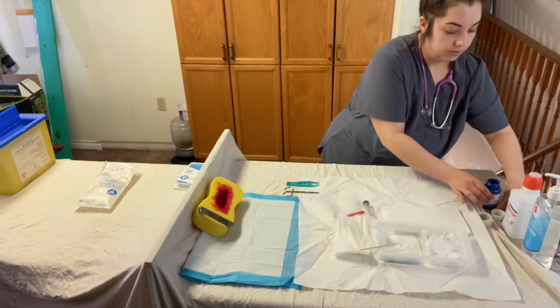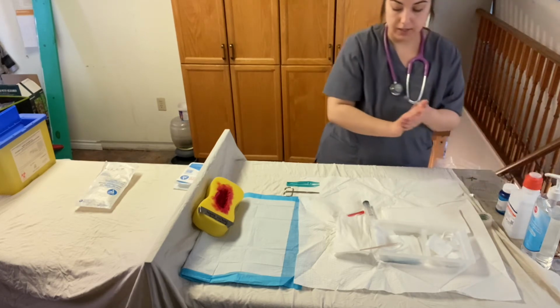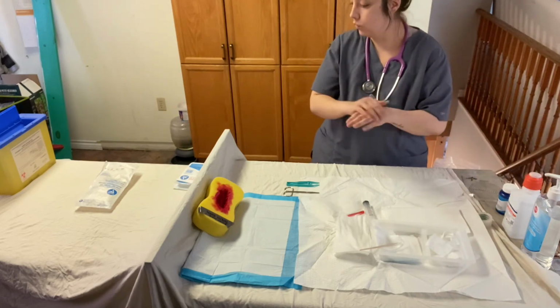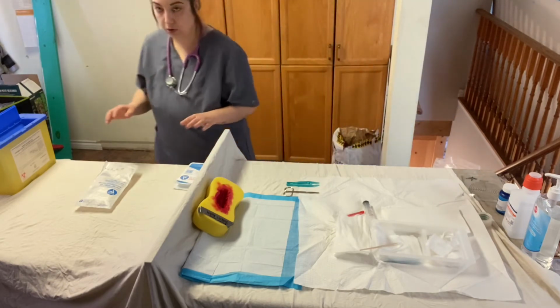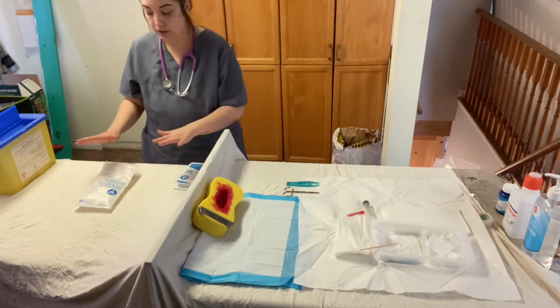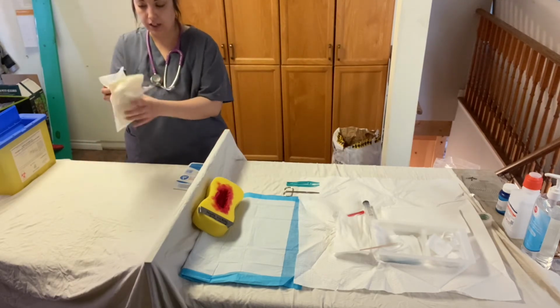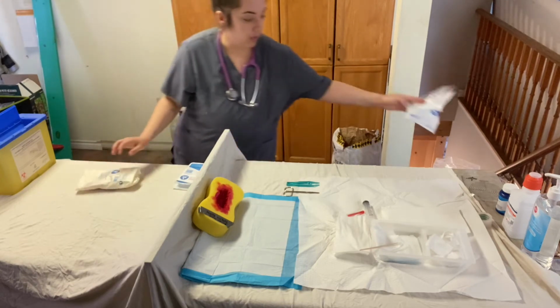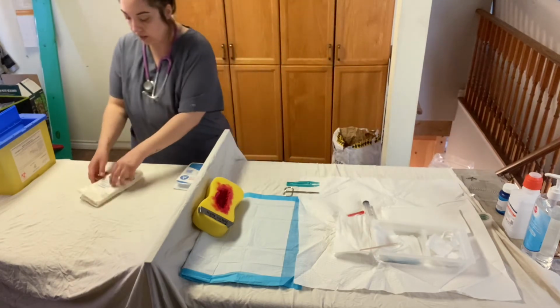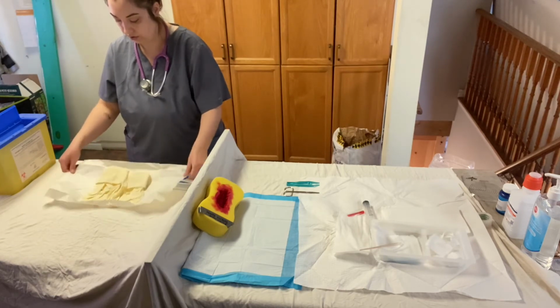And same with my ribbon gauze. And then I'm going to perform hand hygiene. And I'm going to go over here and, never putting my back or turning away from my sterile field, I'm going to apply my sterile nitrile gloves. I'm able to touch the outside. Just going to throw that in the garbage. And again, just maintaining my 1-inch border of sterility.